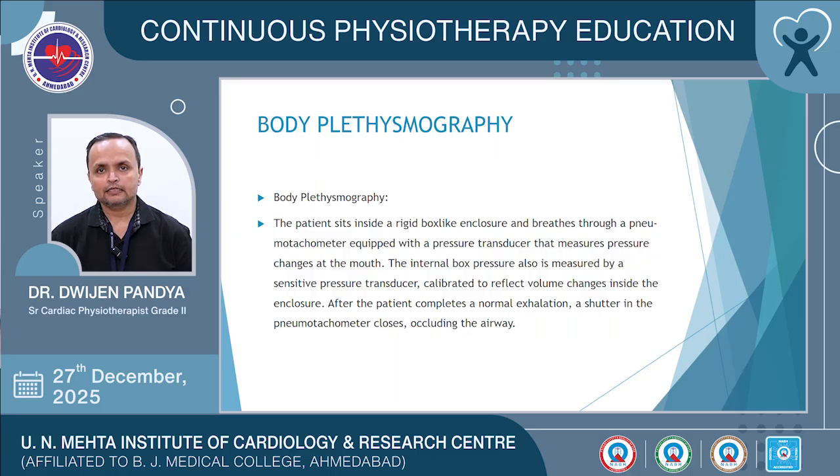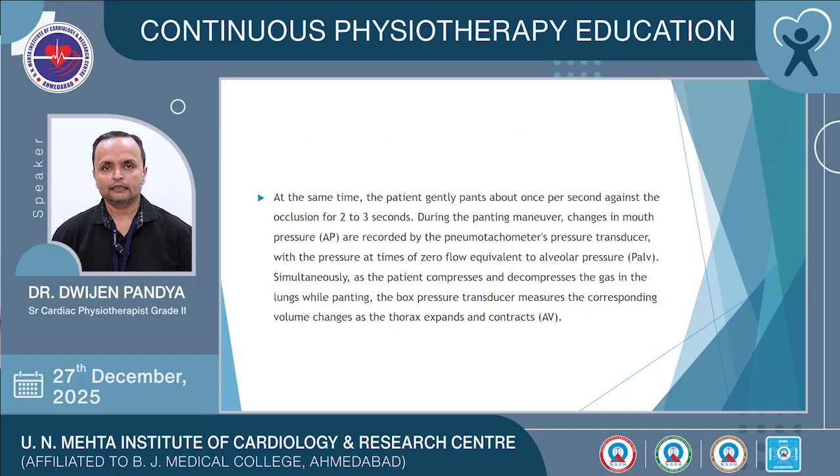After the patient completes a normal exhalation, a shutter in the pneumotachometer closes, occluding the airway. At the same time, the patient gently pants about once per second against the occlusion for 2 to 3 seconds. During the panting maneuver, changes in mouth pressure are recorded by the pneumotachometer's pressure transducer, with the pressure at times of zero flow equivalent to the alveolar pressure.